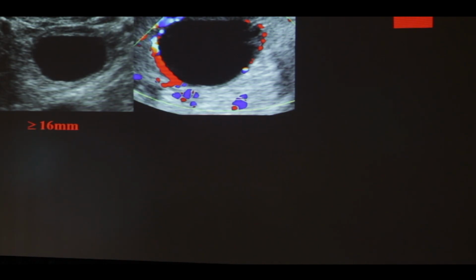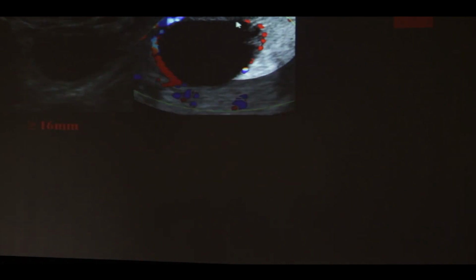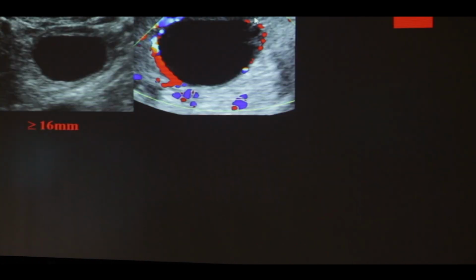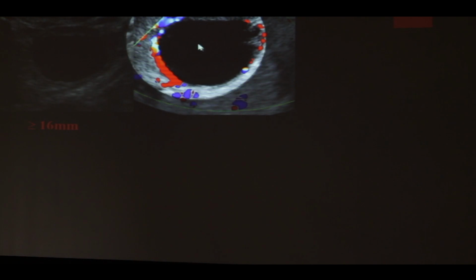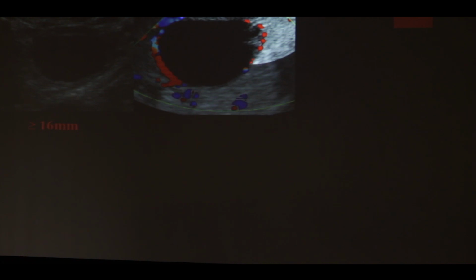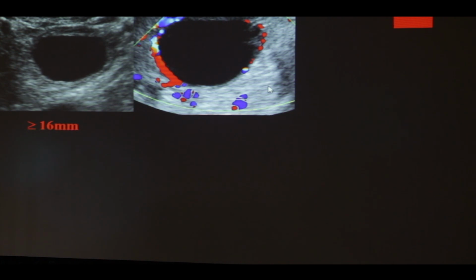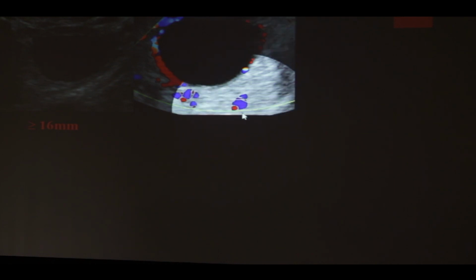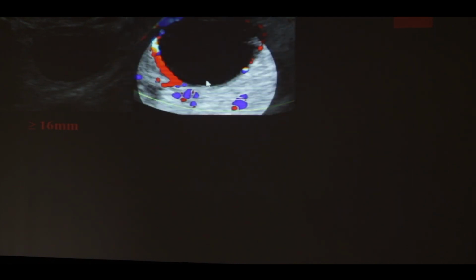How? Because on the top it is missing, it is missing from the bottom, it is not missing from the sidewise. Here I am seeing the flow like this, but the striking angle is 90 degrees here and here. I will take the section from the other side. This side may be missing vessels, but here and here it will be coming. So if you see a vessel coming from this side and this side, it automatically means that it is there on the top and in the bottom.